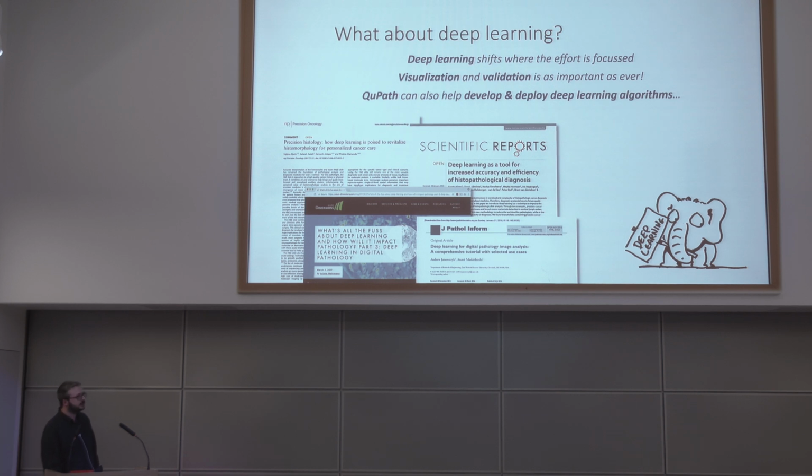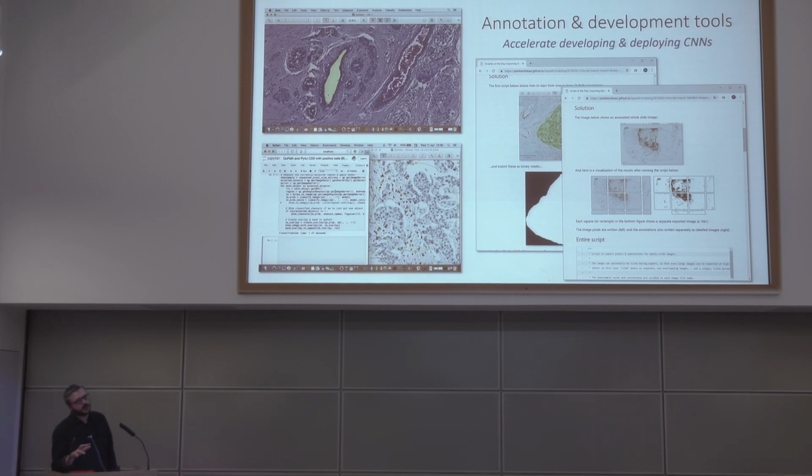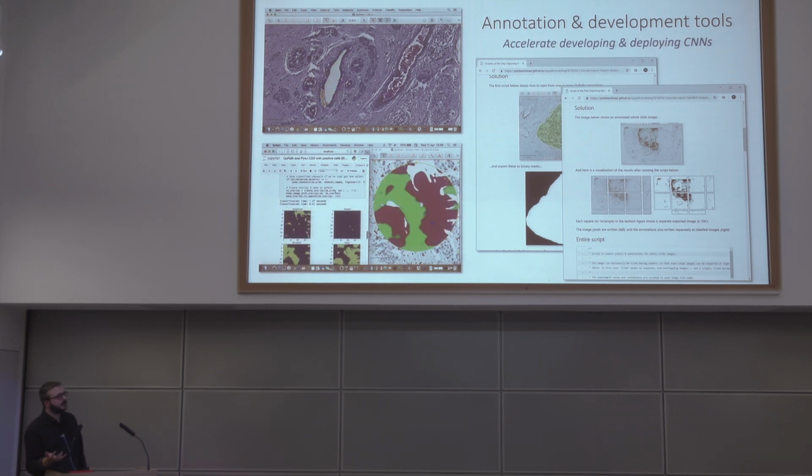It's certainly in pathology image analysis, but much more broadly as well at the moment. And one of the things that I'm trying to do with creating these tools within QuPath is to make them extend and apply to deep learning as well. So I know that one of the ways QuPath is widely used is purely as an annotation tool, both in academia and industry, to create annotations of regions and then train up a deep learning model afterwards.